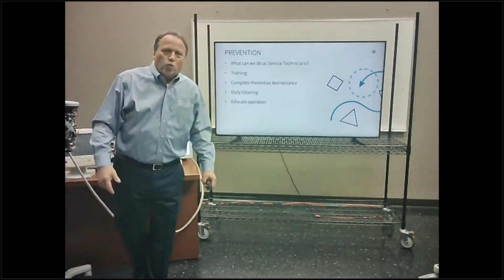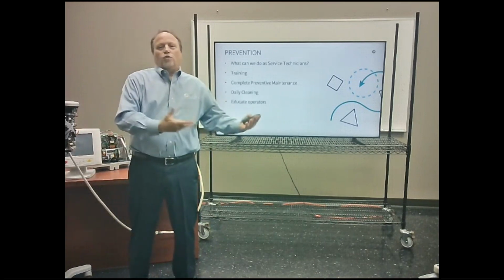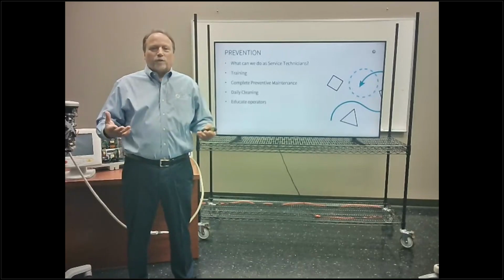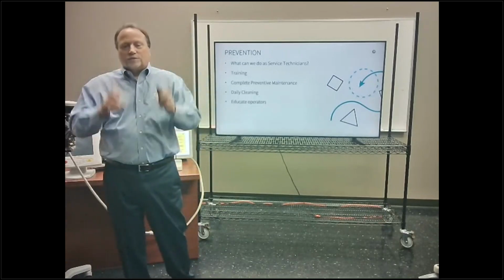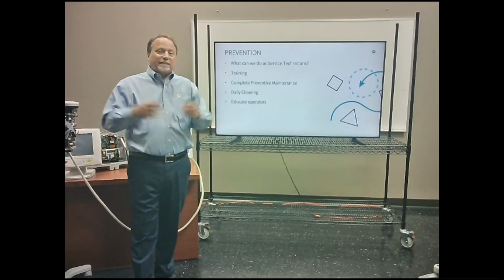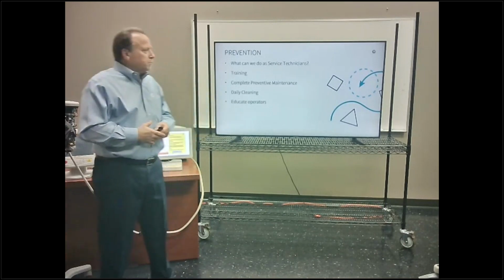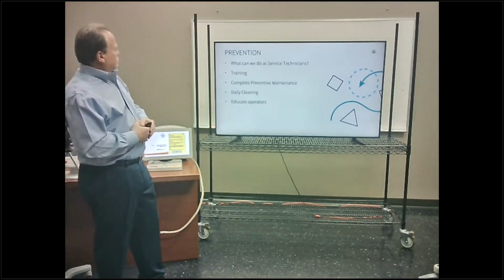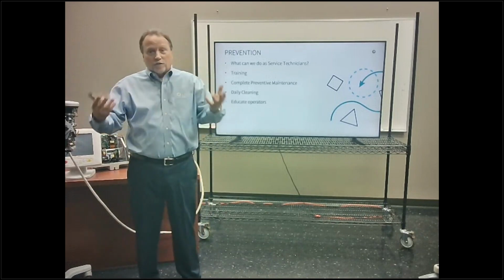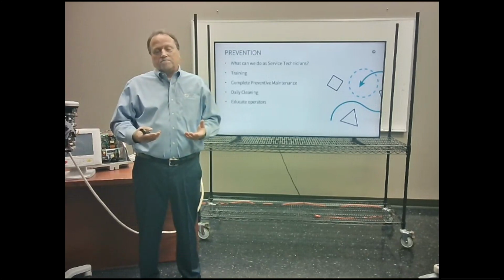So prevention. What can we do as technicians to prevent all these errors occurring, the damage and issues that we have? What type of preventive work can we do to these injectors to maintain them and have them operational as much as possible? Well, training. Even though I am an instructor and I train on these, it's always nice to know what you're doing when you go to work on something.